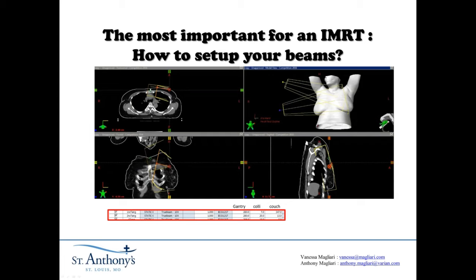It looks like we got almost quite a few degrees off of AP here. This would normally be my first beam, but since we were allowed three non-coplanar, we actually kicked the couch 13 degrees in either direction and split that up, because this first beam will often have quite a bit of fluence, quite a bit of monitor units, and have entrance dose that could streak. By splitting up where the source of these beams come from, that entrance dose was spread across two. This is something more unique to the plan competition than what I do in the clinic, because the therapist probably wouldn't appreciate it if I asked them to move the couch three times. But regardless, these are the first two beams.